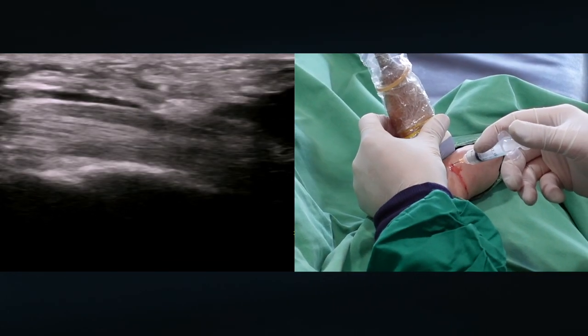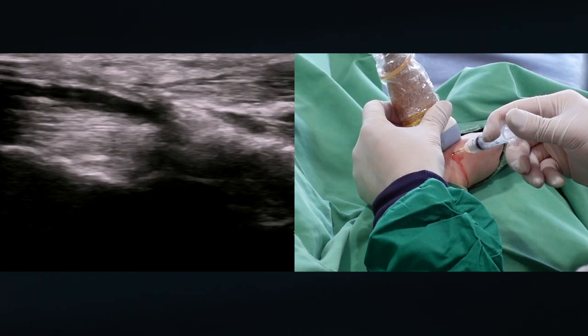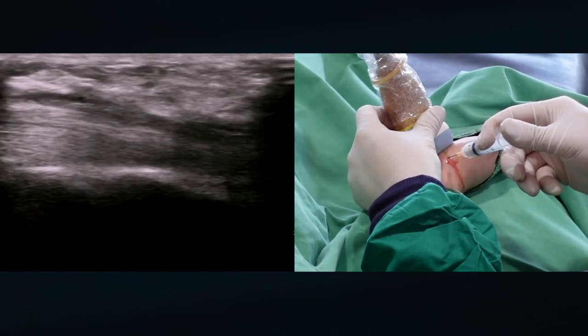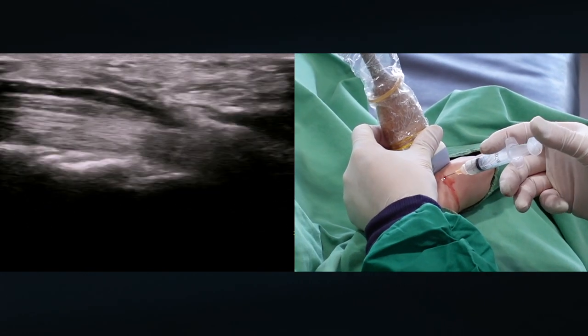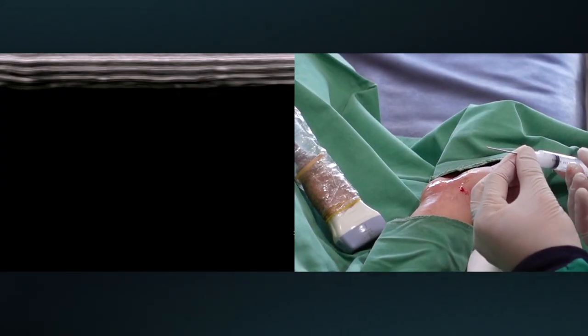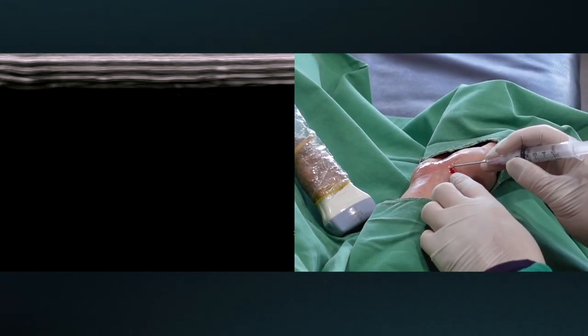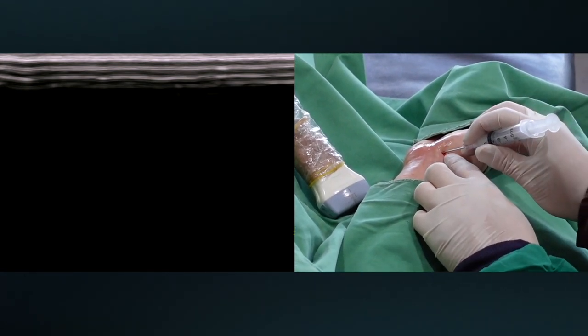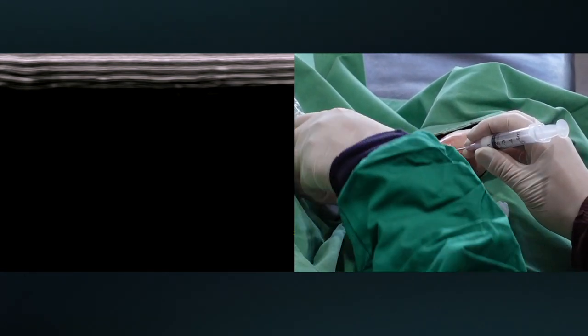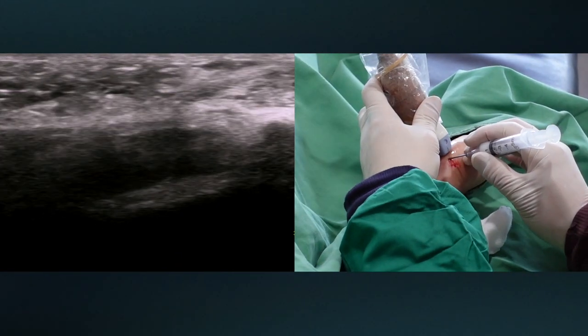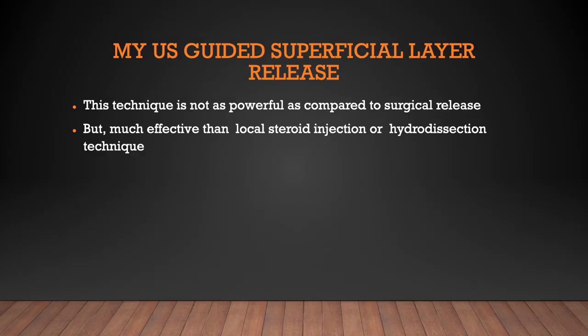Hydrodissection between the transverse carpal ligament and the median nerve provides a safe margin for the transligament release. Observe the fluid in between the median nerve and the overlying ligament structures. I assemble the bevel tip needle with a 5 ml Luer-lock syringe. I will use it as a small blade release, much more effective than local steroid injection or hydrodissection technique alone.